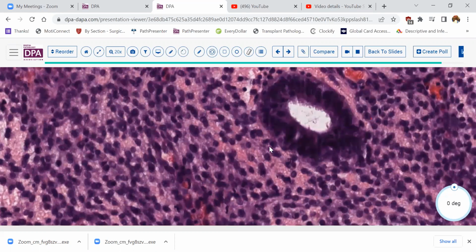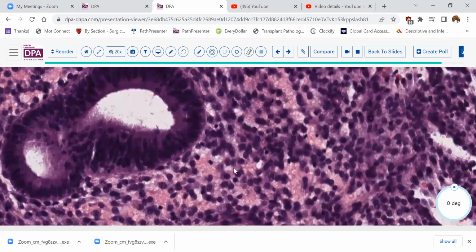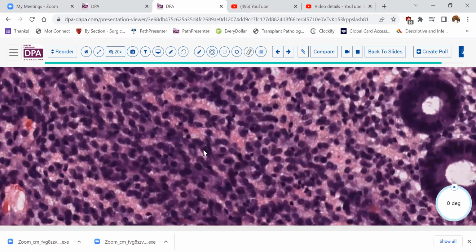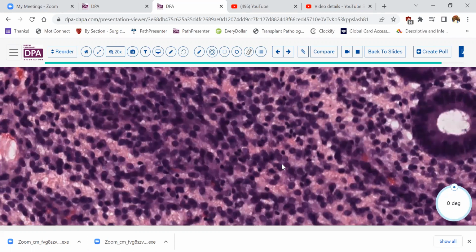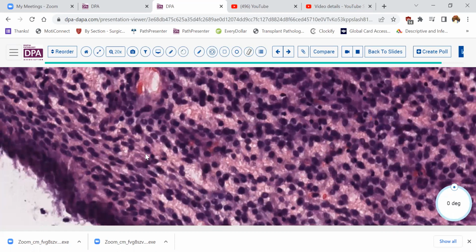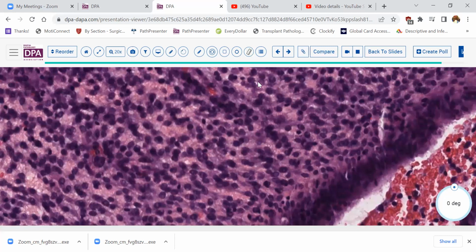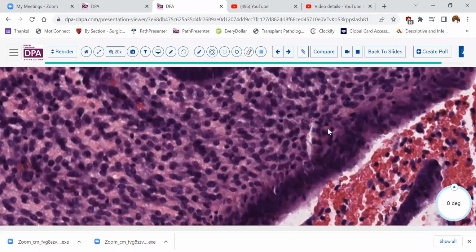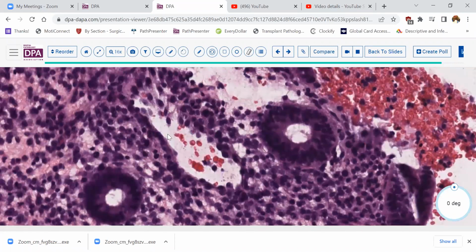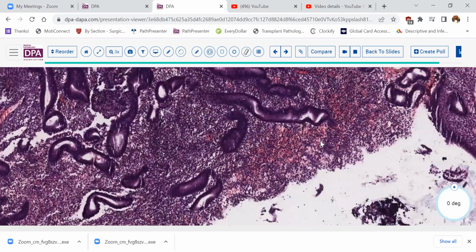So I wondered in this circumstance, why would we have a benign endometrium in a patient who has abnormal bleeding? Searching around in this case and looking at her stroma, I began to wonder if she might have an inflammatory process that would explain her bleeding. She does have occasional glandular mitoses, so there is some proliferation still going on here. But consideration, given her symptoms, of an inflammatory process was made.